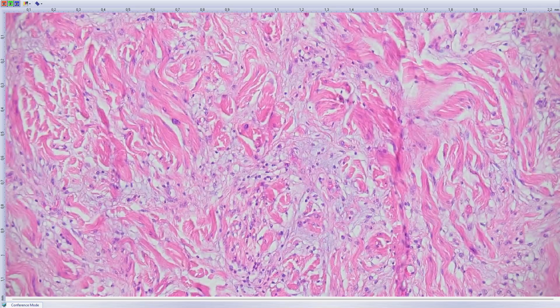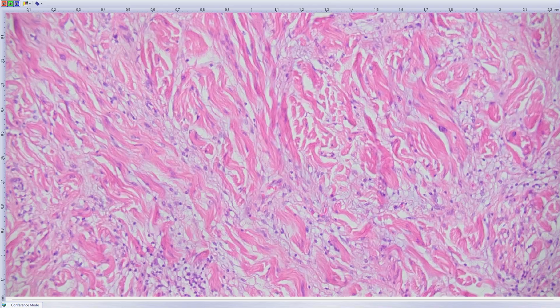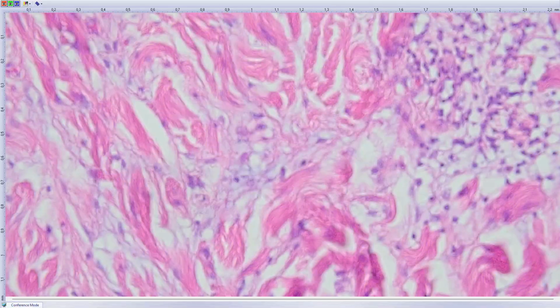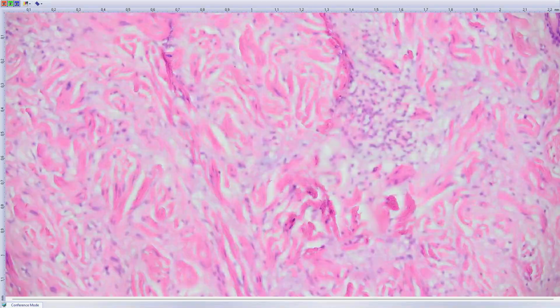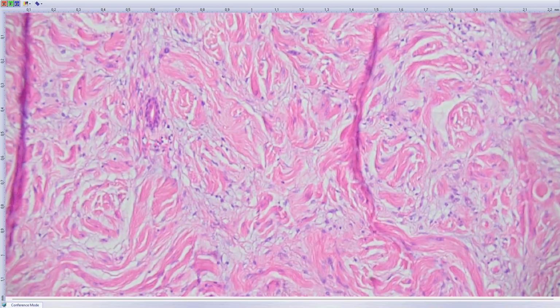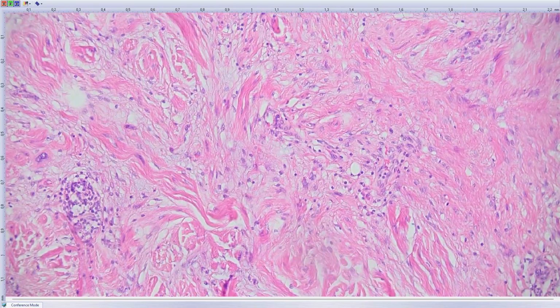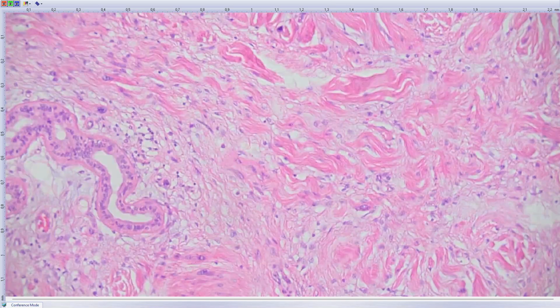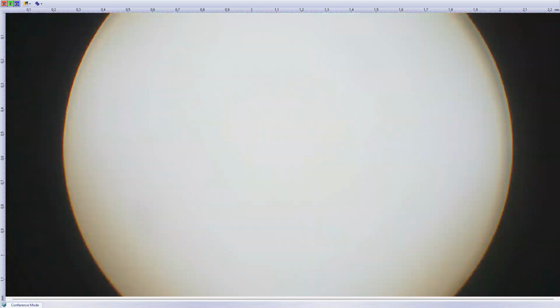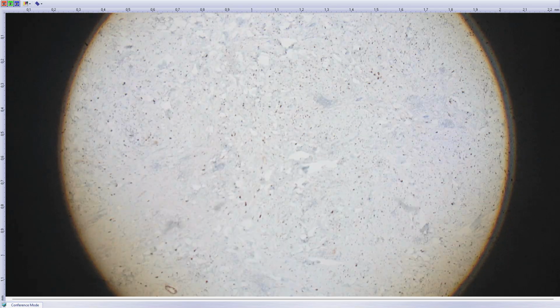tumor with clear cytoplasm, again very bland nuclear features, especially in some areas when more tumor cells are present next to each other. It's better appreciable. So if you know the diagnosis, it's easy. You go straight for SOX10, S100, and perhaps inhibin to confirm the diagnosis. If you don't know, you can start with some default immunohistochemical panel, which also contains SOX10 and S100. And so this tumor is diffusely SOX10 and S100 positive.